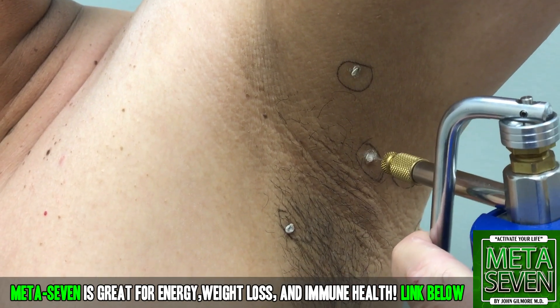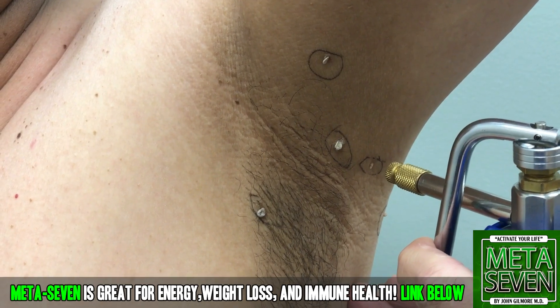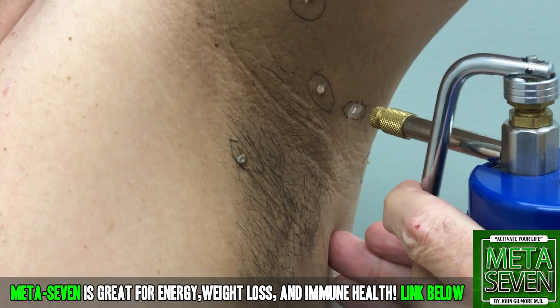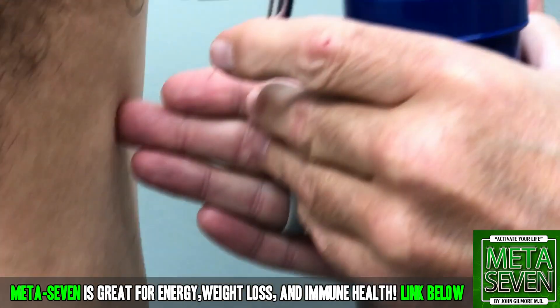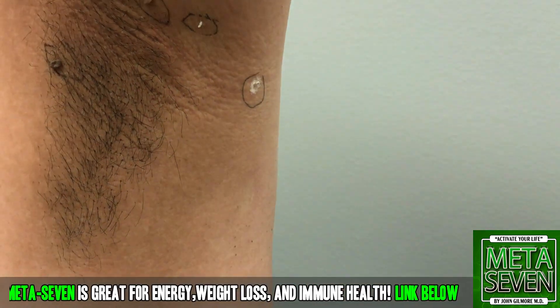I tried to put it in — you put enough in? Well, maybe not. Obviously we're running low on liquid nitrogen right now. We have enough to do this the first time, and we'll get some more for the second round. We're going to do them all twice.